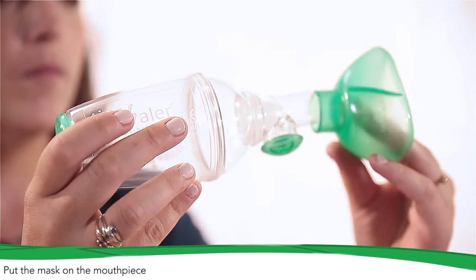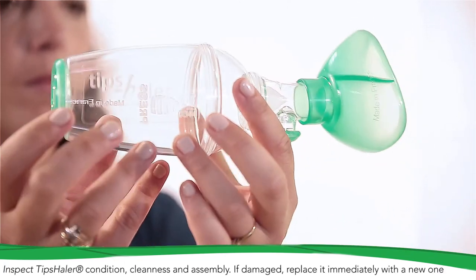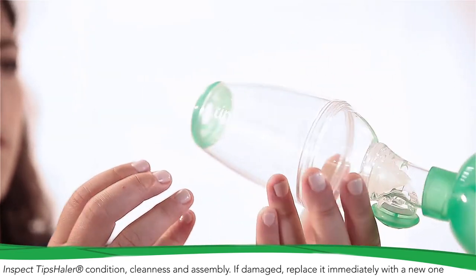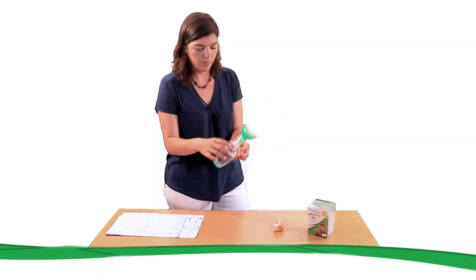Put the mask on the mouthpiece. Before each use, make sure that TIPS-HALER is in good condition. Please also check that all parts of the TIPS-HALER are well connected and don't contain any foreign matter. If damaged, replace it immediately with a new one.